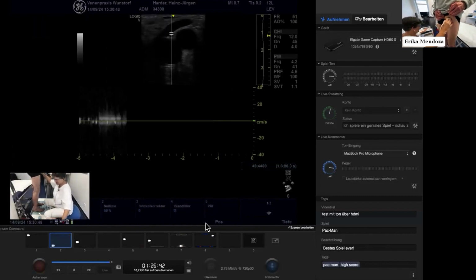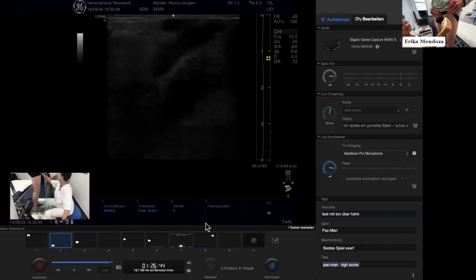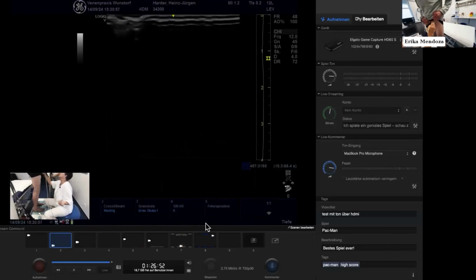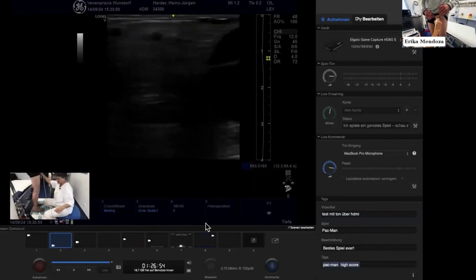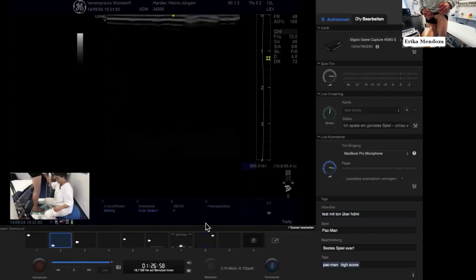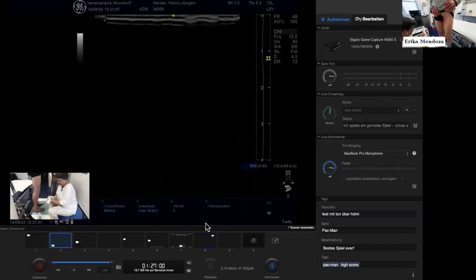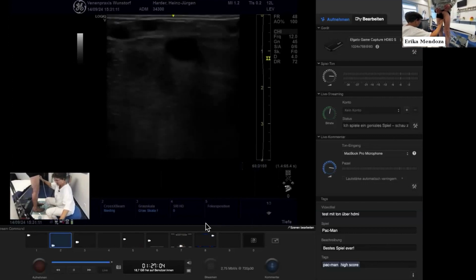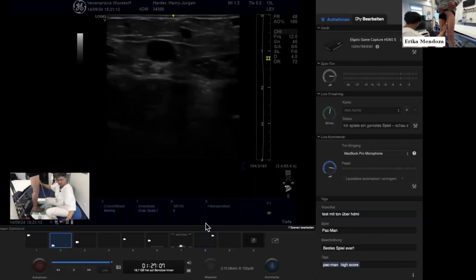Okay, so we start doing the exploration. When he came, I said, but you have had like a surgery here or a catheterism or something. No. He doesn't remember when it started, but it's a long time ago that he has it. And I just want to show you the problem. Of course, you can operate this. You have got a surgeon, you can operate this. But I just start here, mid-thigh.